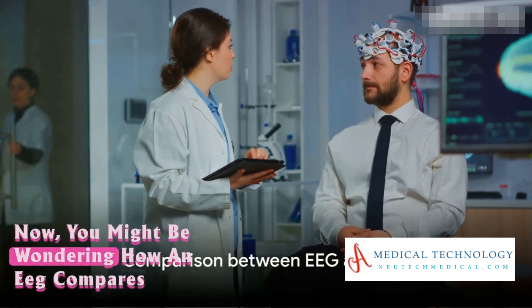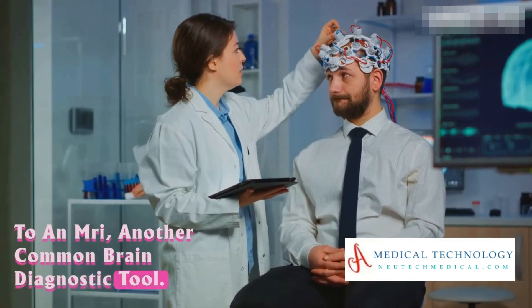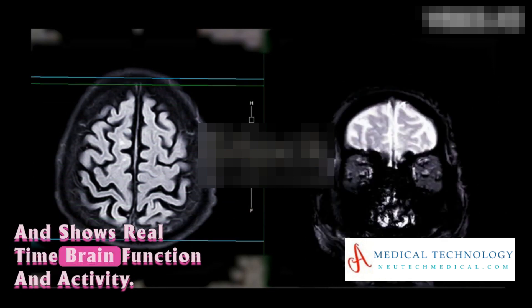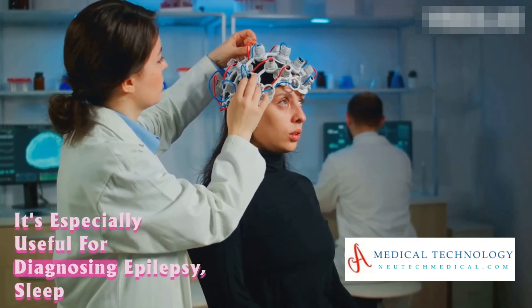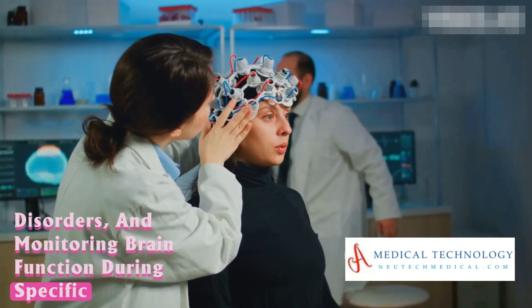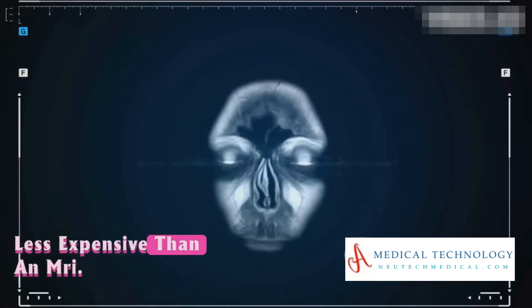You might be wondering how an EEG compares to an MRI, another common brain diagnostic tool. An EEG measures electrical activity in the brain and shows real-time brain function and activity. It's especially useful for diagnosing epilepsy, sleep disorders, and monitoring brain function during specific tasks. It's also non-invasive and generally less expensive than an MRI.